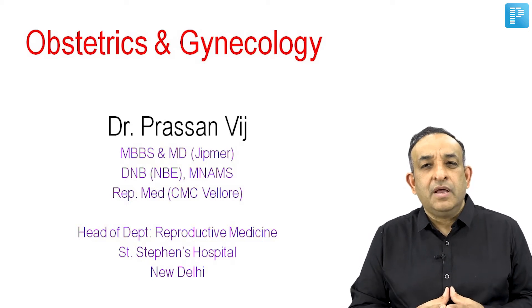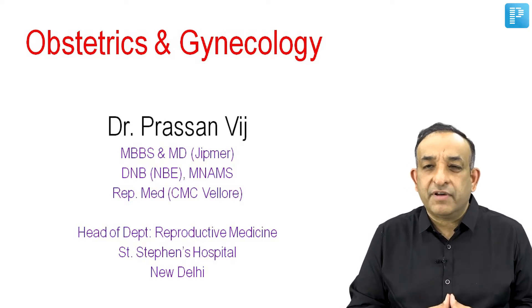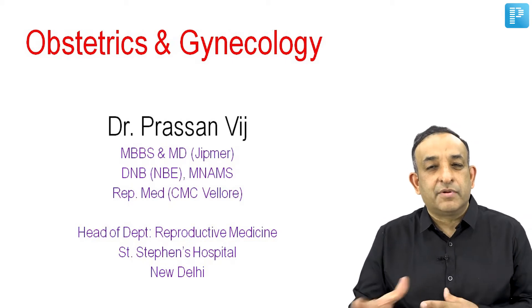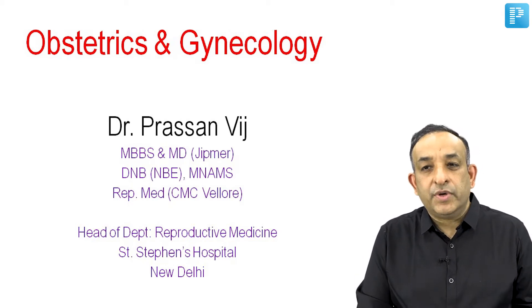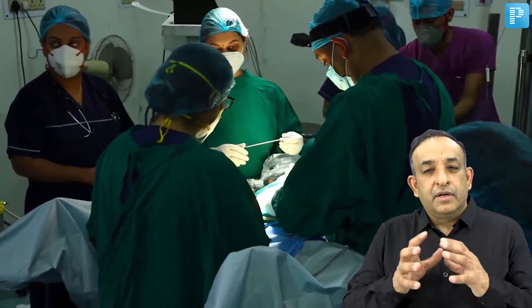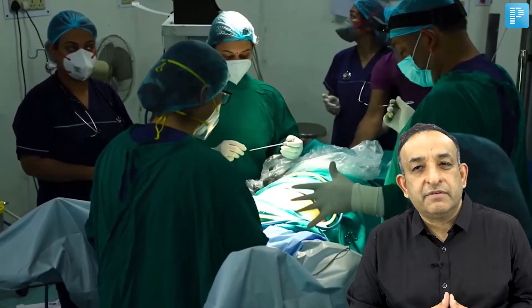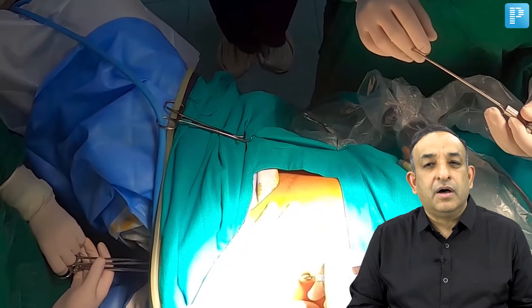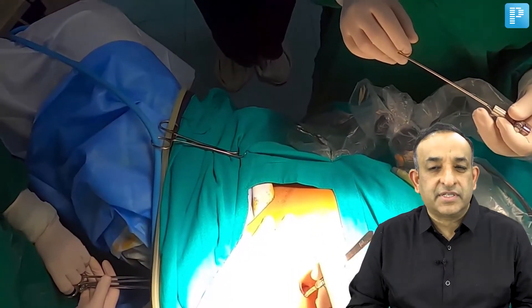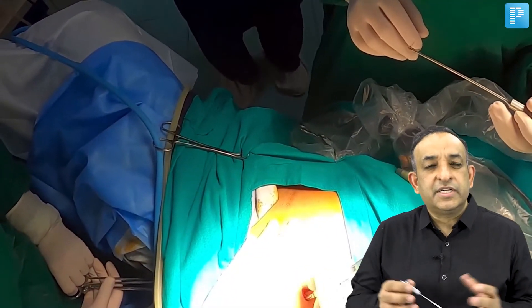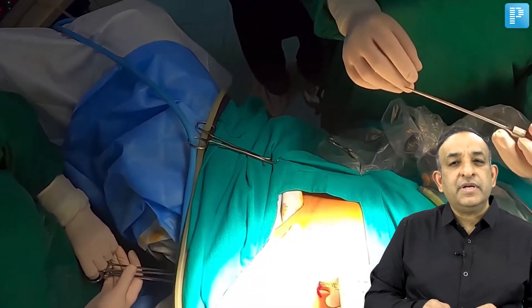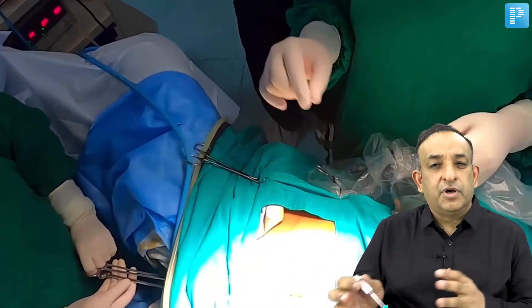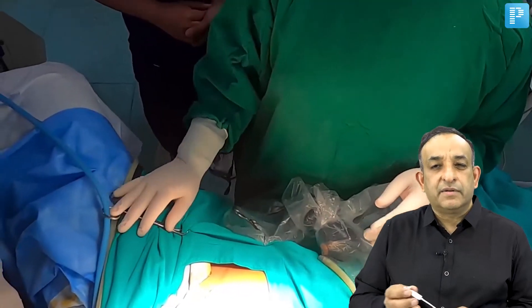I did this laparohysteroscopy along with my fellows of reproductive medicine and some postgraduates from the department of gynecology. When doing laparohysteroscopy, the first thing is to enter the abdomen and make a pneumoperitoneum by putting in carbon dioxide to distend the abdomen. Entry into the abdomen is done by the Veress needle.